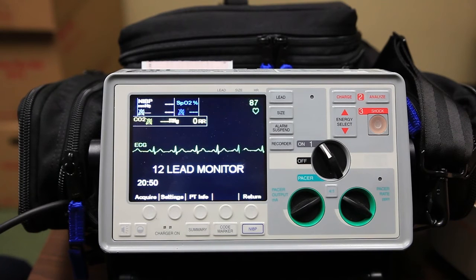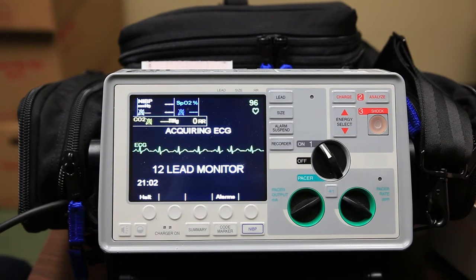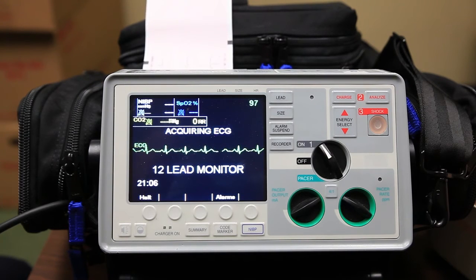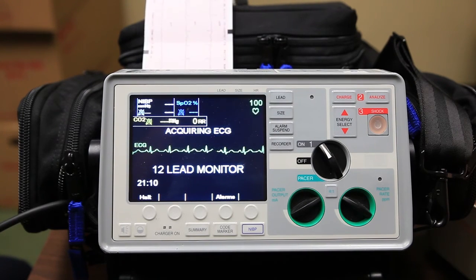Once you have the chest leads placed and the patient information entered into the monitor, return back and hit Acquire. Remember to have your patient stay still, breathe normally, and not speak while the acquisition is taking place.